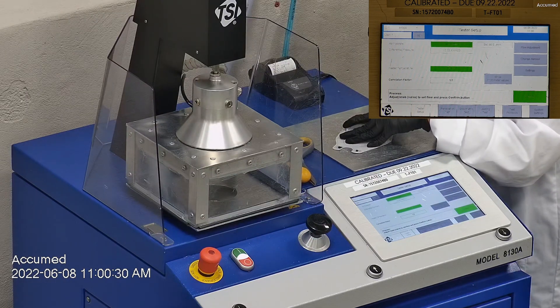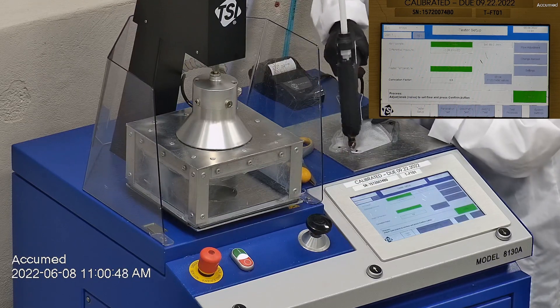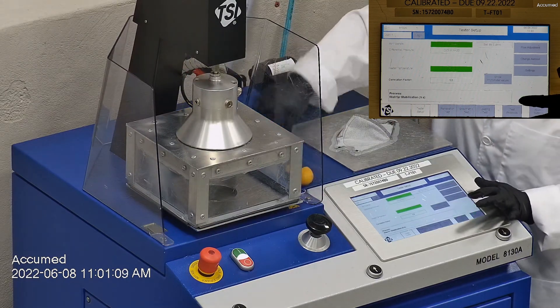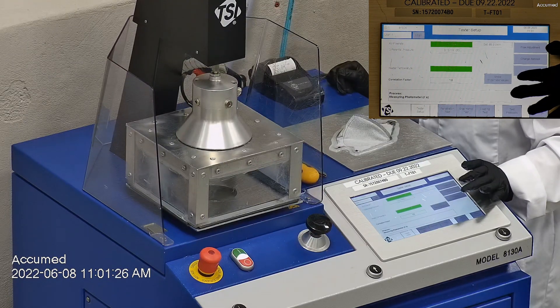Then we make sure that the mask is properly and completely sealed with hot glue to the testing plate. When applying the hot melt glue we make sure that there are no holes or leakage around the seal to ensure accurate results. The testing plate is attached to the frame and the box is placed under the TSI filter holder for testing. The results are displayed on a TSI monitor.